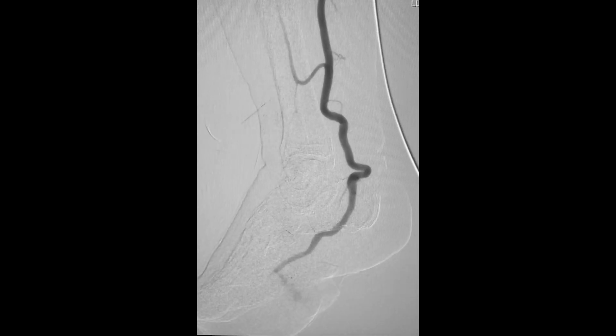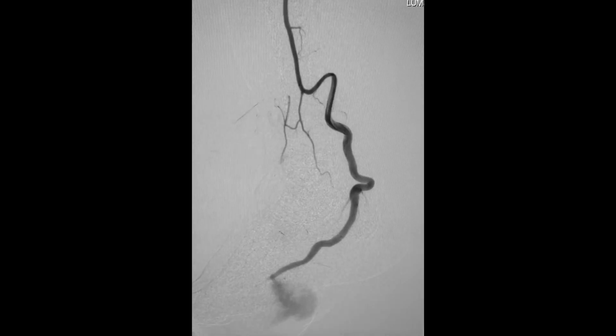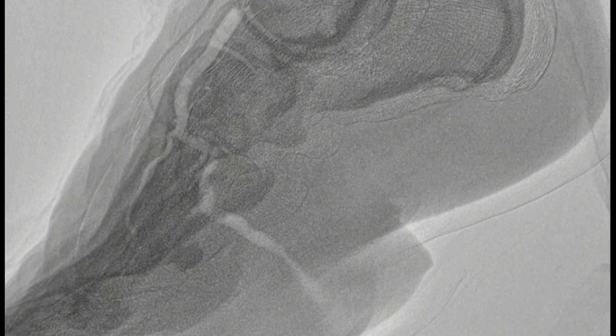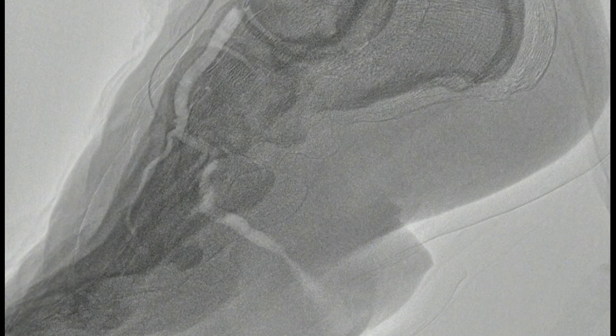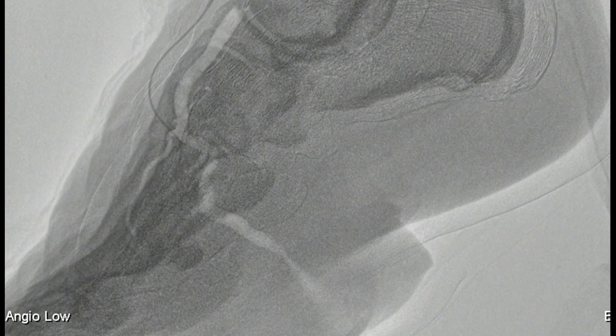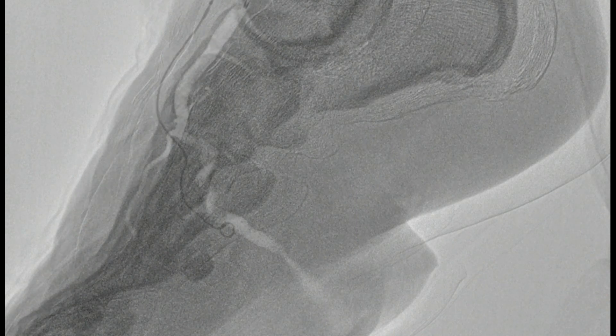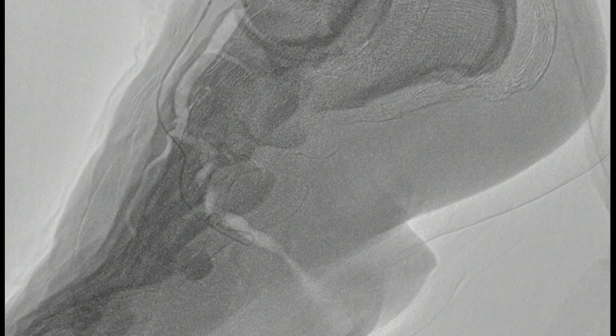So we did an elective angiogram. You can see his posterior tibial artery is huge. There's this jet into the aneurysm. There was a similar jet visible off the anterior tibial artery. We consulted orthopedics and plastic surgery, but initially chose to go ahead and embolize the branches coming off the anterior tibial artery preemptively.